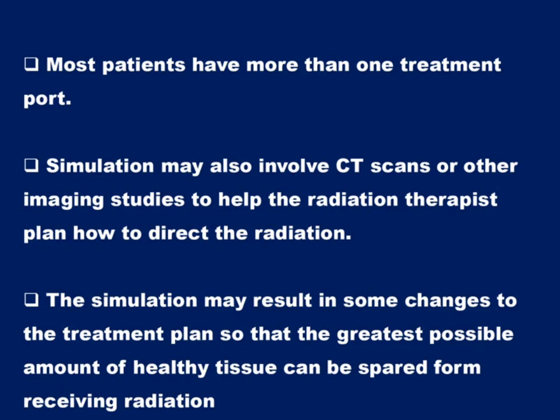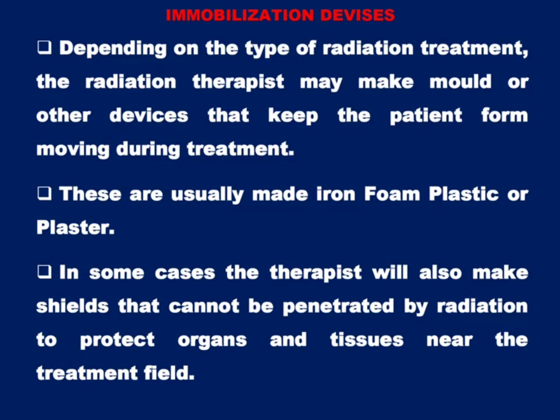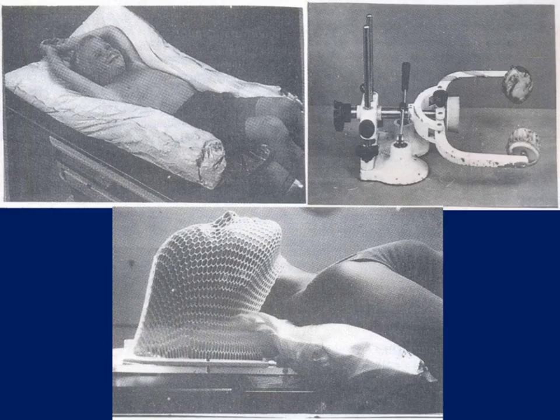The 3D planning relies basically on 3D computed tomography. The beams can be much better delineated with respect to soft tissue boundaries, whereas in 2D we were based only on bony landmarks. Modern linear accelerators with multi-leaf collimators produce irregular field shapes without the pain and difficulty of designing blocks in 2D planning. Here we can easily create an irregular field with the help of a multi-leaf collimator without using blocks. Treatment verification in 3D conformal radiotherapy is still a problem.